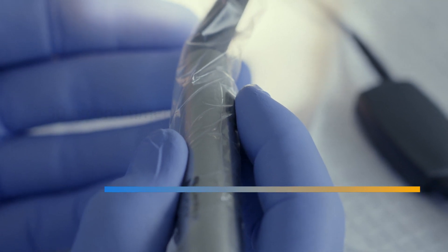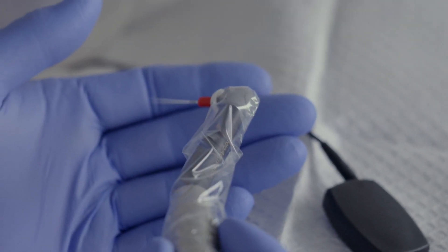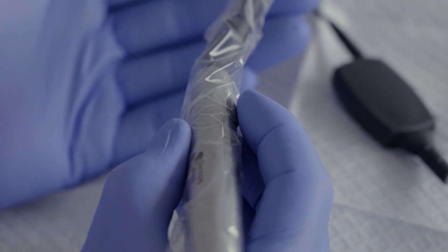It's got a timer on it — at 30 seconds, you just heard it beep. So now you don't have to count in your head whether you're running it for 30 or 45 seconds. It just dramatically improves the cleanliness of the canal, and we all certainly think that the cleaner the canal, the better the chance for success — and the better the post-op outcome for our patients as well.